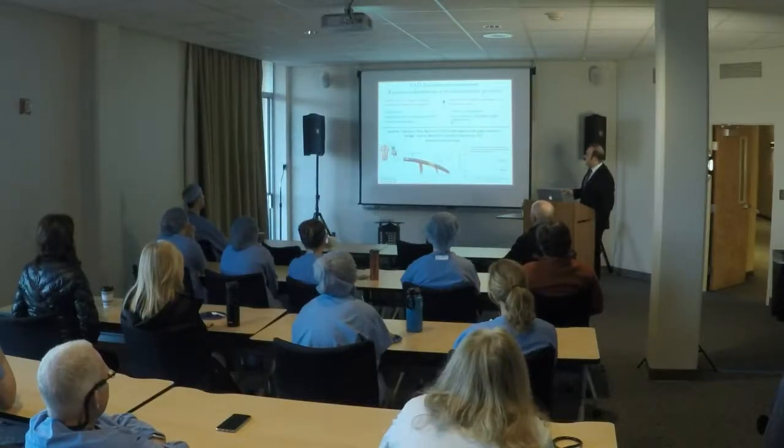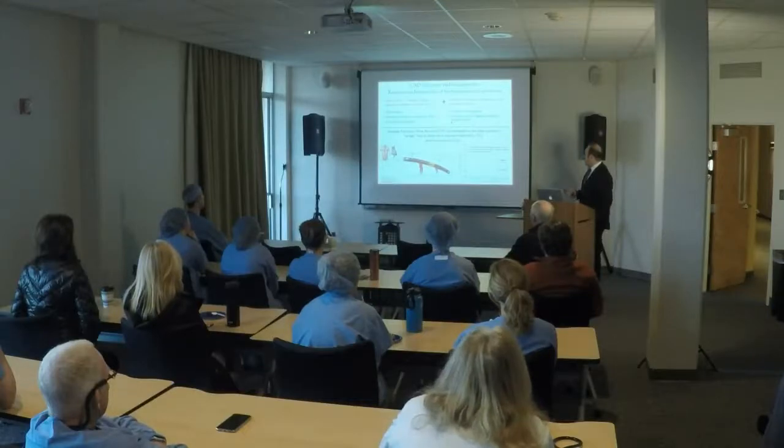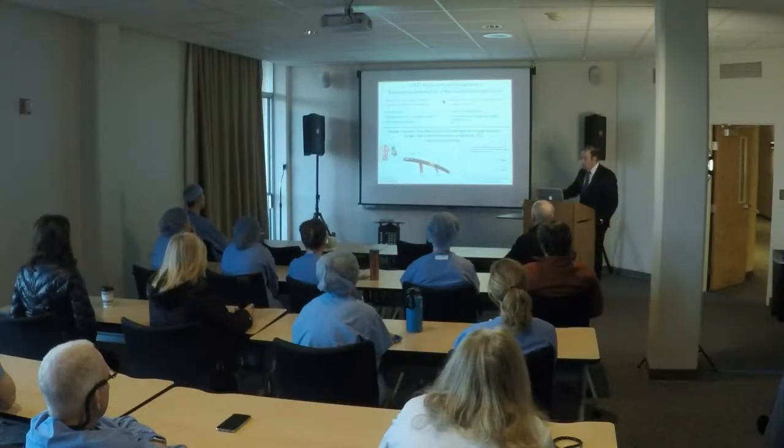And we just talked about how FFR, or fractional flow reserve, has emerged as the gold standard bridge test to determine optimal medical versus percutaneous intervention artery-specific therapy. Now, using fractional flow reserve to guide therapy has resulted in a 33% reduction in the risk of death or major adverse cardiac events, and has translated into a reduction in overall healthcare costs.